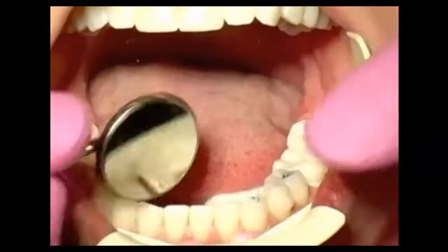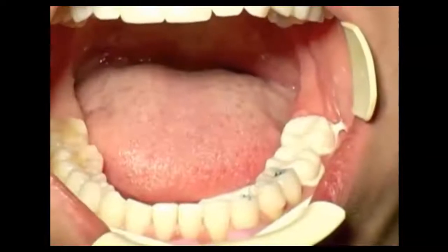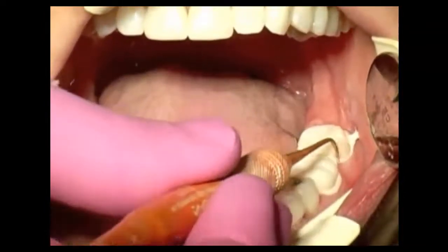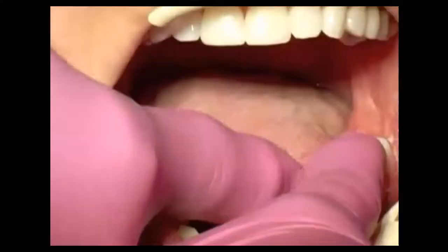So temporary cement has been placed in there once the adjustments are made, and the excess cement that has squirted out is going to be removed. And in this case, they're going to be light curing it on, just to again give it a little bit more strength and stability. Because you do want those temporary crowns or provisional crowns to stay on there for the amount of time until the permanent restorations are going to be delivered.